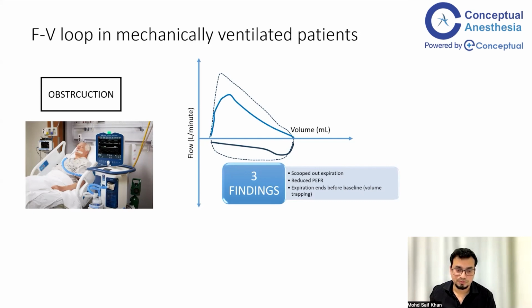And now this is your inspiration. So even inspiration is blunted here. So peak inspiratory flow rate and peak expiratory flow rate both will be diminished.